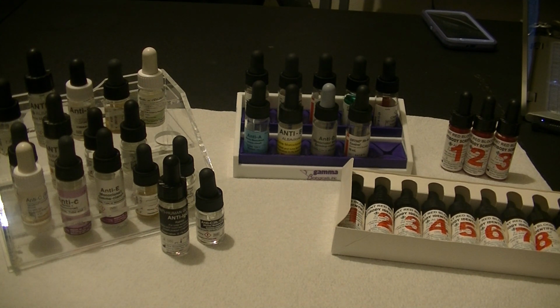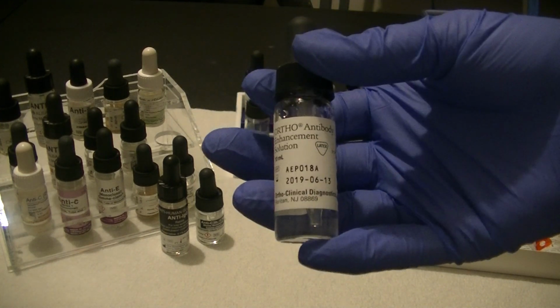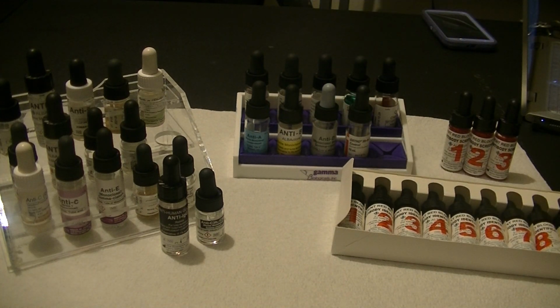Potentiators increase the potential of red blood cell agglutination or cross-linking. So they enhance antibody attachment or help agglutination occur. We've already talked about one of these, and that is LIS, low ionic strength solution, and this brand Ortho calls it enhancement solution, but it is low ionic strength solution. We also mentioned PEG, bovine serum albumin, and enzymes as other potentiators in our previous lecture. They are discussed more in depth in Chapter 3.